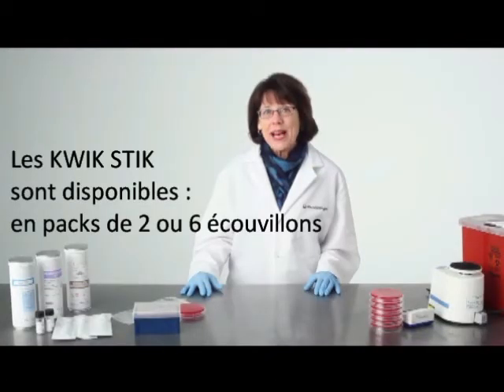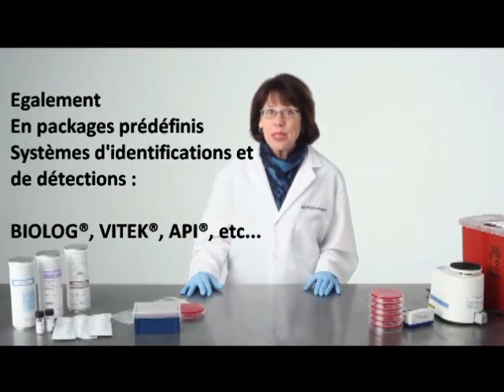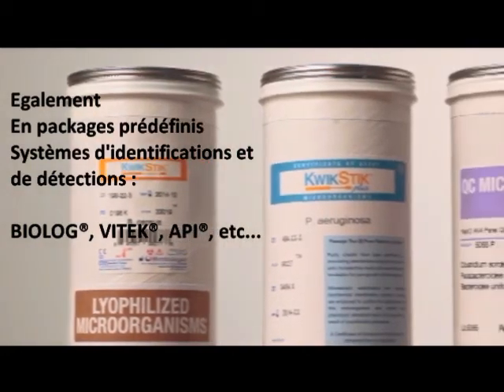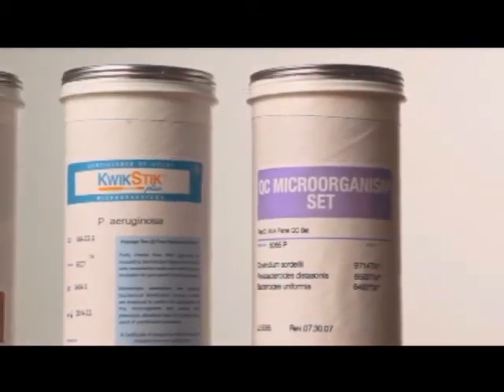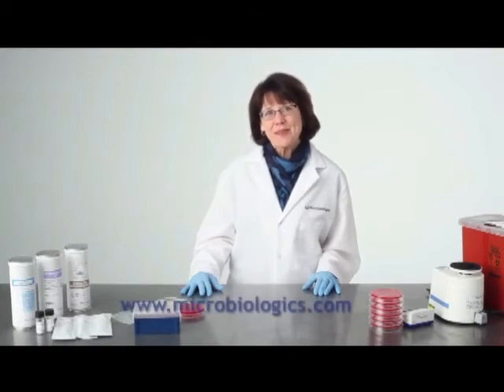Quick sticks are available in packs of two and six, and are also available in pre-packaged QC microorganism sets for use with identification and detection systems. Visit our website for a complete list of microorganisms.